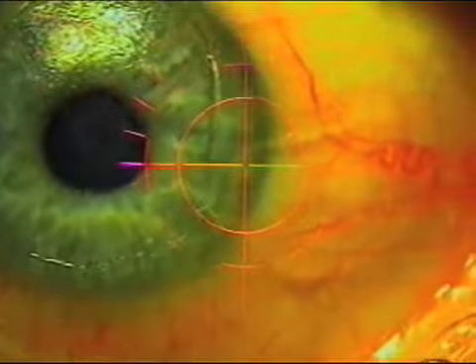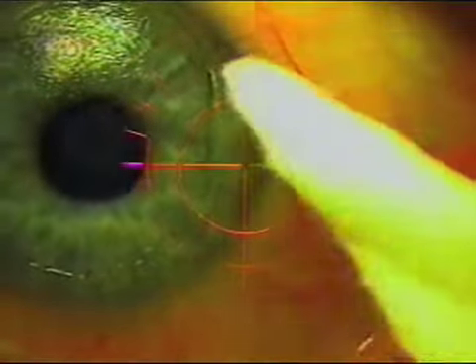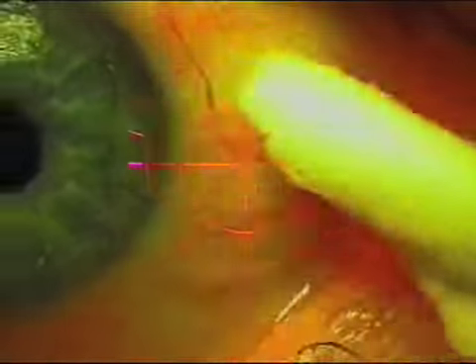But I wanted to mainly demonstrate the lifting of the flap, and I think that with this technique, the epithelial surface stays much cleaner, and it's much less likely to develop problems like epithelial ingrowth or irregular flap edges when you're trying to lift directly at the operating microscope, because the edge of the flap is just extremely difficult to see, even with some of the depression techniques. And again, here you see me removing epithelium from the back of the flap.